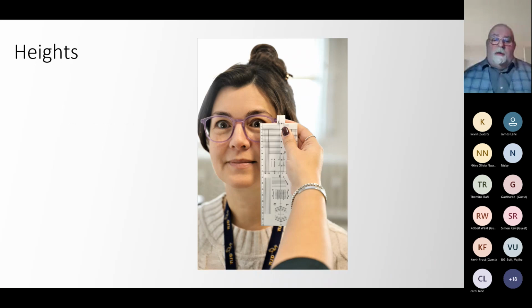So what we've got here is the frame on the patient, and we are resting the ruler onto the front of the frame. And this is being measured for a PPL. And so we're looking for the pupil center. And what we are doing, we're measuring from the lower tangent to the frame, and we're at the inside of the frame rather, and we're measuring up to the pupil center. We've got the ruler pressed against the frame, and again you can see that Kat has got a couple of fingers resting onto the side of the head.